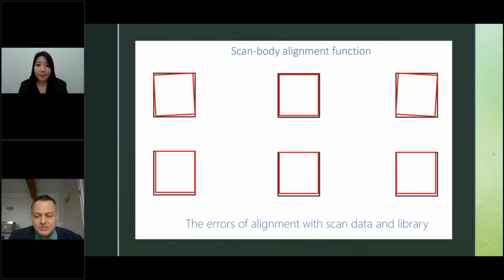If you do this, when your scan goes to the technician, he needs to make a crown with the correct emergence profile, and because he doesn't see anything there, he's just going to make assumptions as to how the gingiva is correctly profiled. You can overpress or underpress the gingiva doing this, and you can also have worse effects, like impinging on the underlying bone.